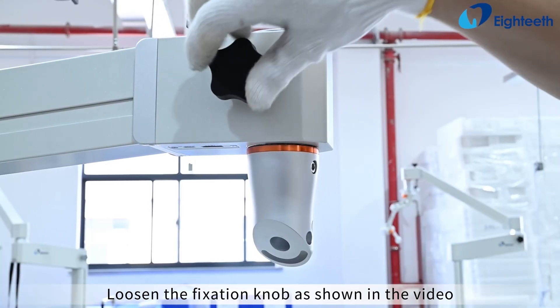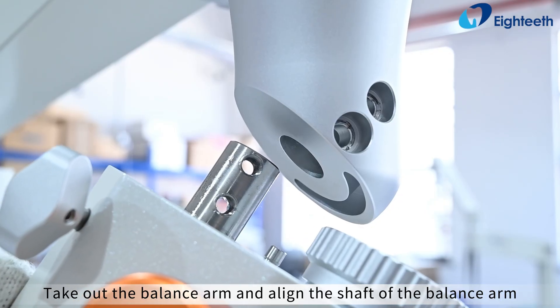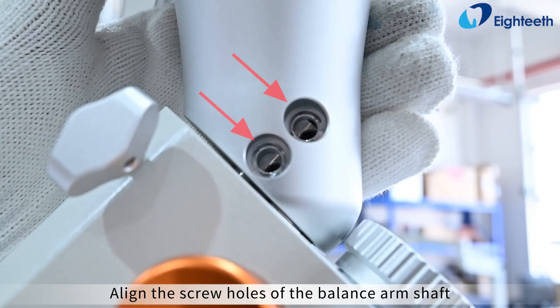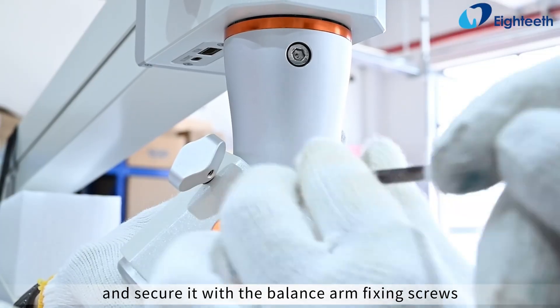Loosen the fixation knob, rotate the C-arm 45-degree connecting block to an easy installation position, then tighten the fixation knob. Take out the balance arm and align the shaft of the balance arm with the connecting block shaft hole, inserting it. Align the screw holes of the balance arm shaft with the screw holes on the connecting block and secure it with the balance arm fixing screws.